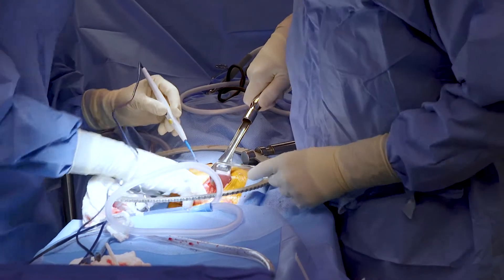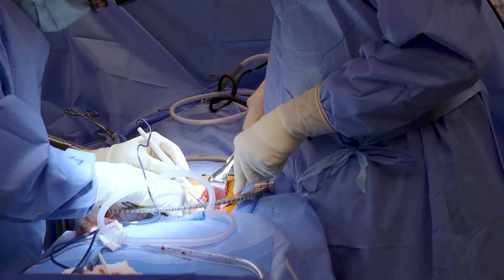It provides not only ease of use to you as a surgeon, but truly provides a much lower complication profile for your patients. Your access surgeon doesn't need to provide a large field of exposure.